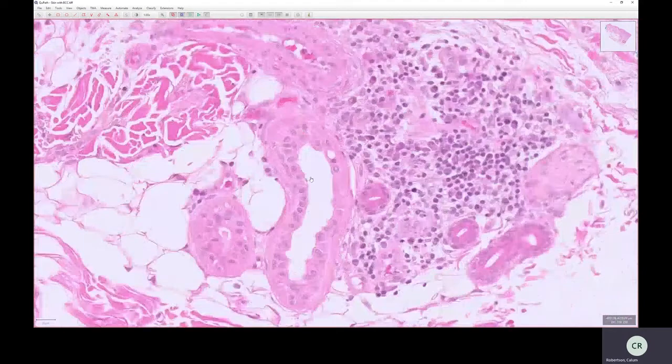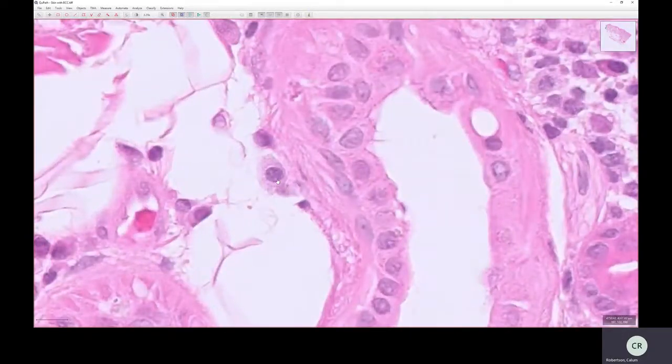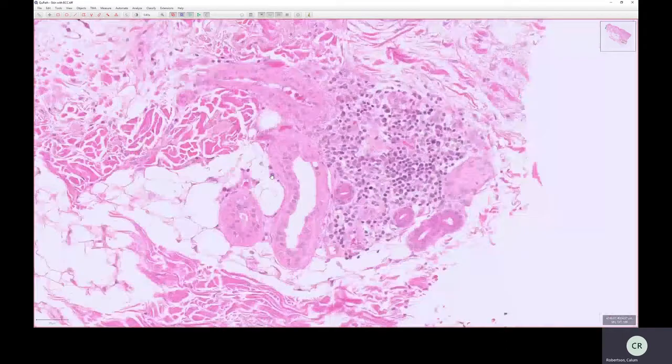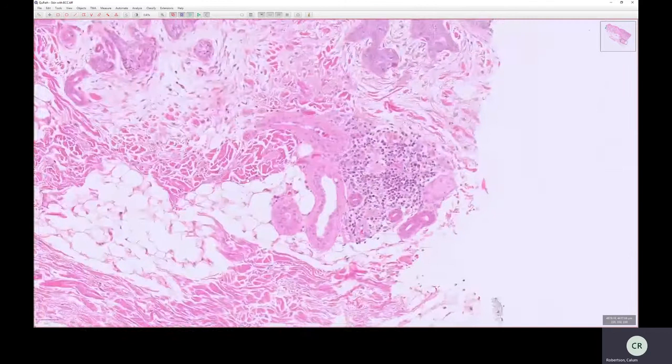I haven't seen a macrophage or a histiocyte. This may be one. It may not be, but this signifies what a macrophage often looks like. So you've got a nucleus here, and you've got this kind of frothy cytoplasm round about it, and that's what a macrophage often looks like. I'm not saying that this is one, it may not be, but it's a good example of what a macrophage looks like. And there's a collection of chronic inflammation here, including lymphocytes and plasma cells. It's not out with the realms of possibility that a macrophage might accompany that, or a histiocyte, because it's in a tissue section.